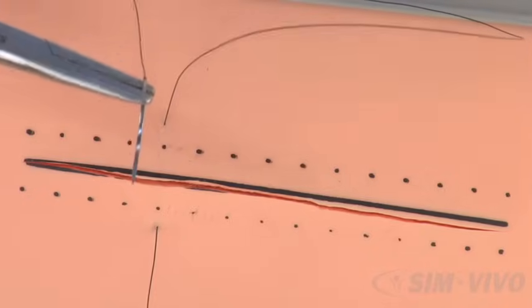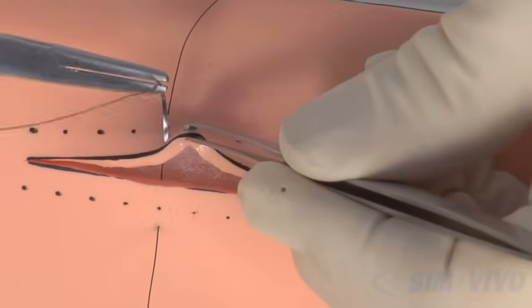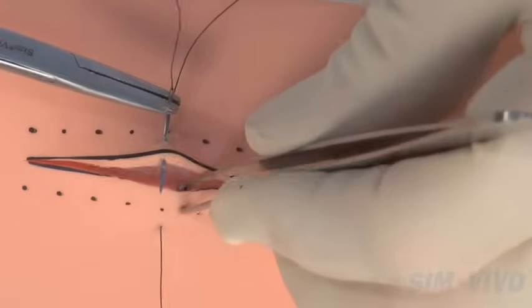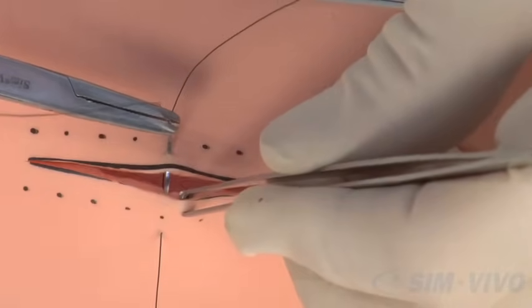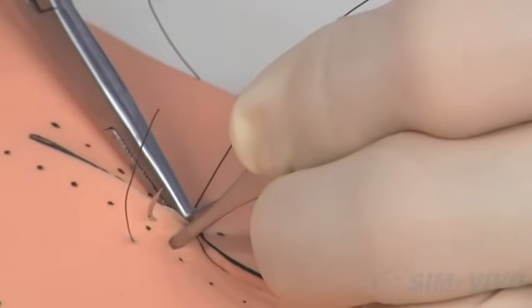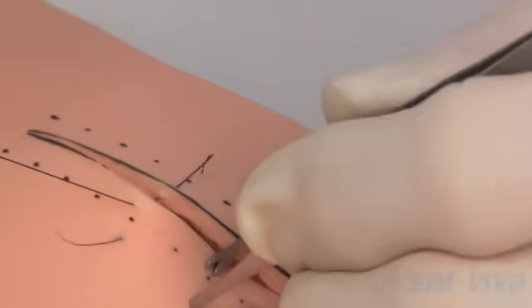Lift up the skin. Enter. And come out about halfway down the skin thickness. Enter on the other side about halfway up the skin thickness and come out through the skin. Hold on to the skin with your adson forceps while you pull the needle on through.